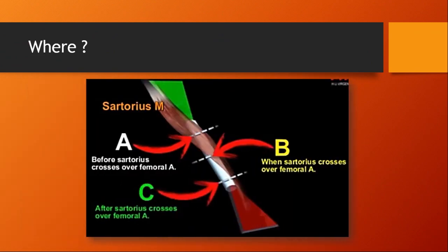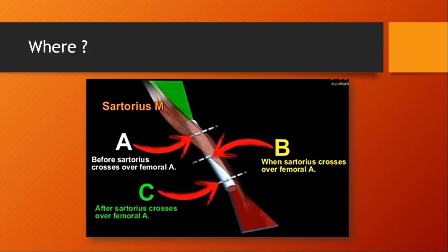There are three levels where the adductor canal block can be placed, based on the position of the sartorius relative to the femoral artery. Level A is before the sartorius crosses the femoral artery — when the sartorius lies laterally to the artery. Level B is at the crossing point, and level C is after crossing, where the femoral artery is found first and then the sartorius muscle. I generally recommend the B approach.